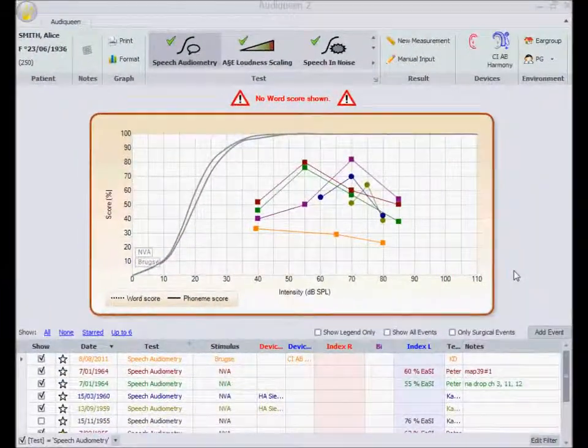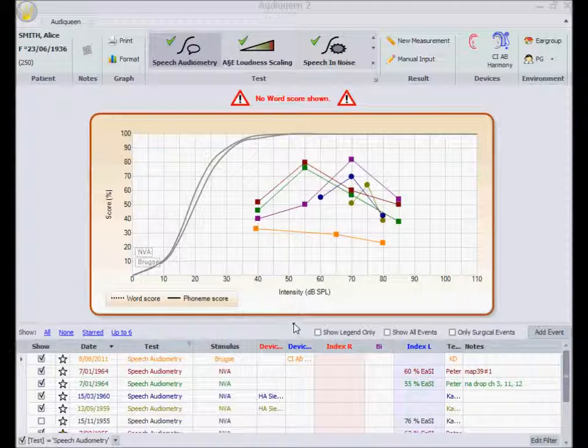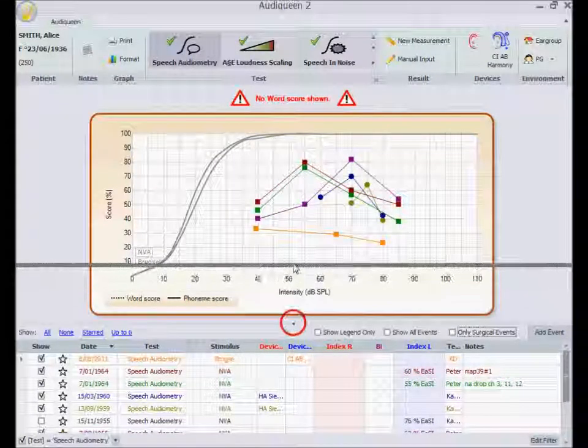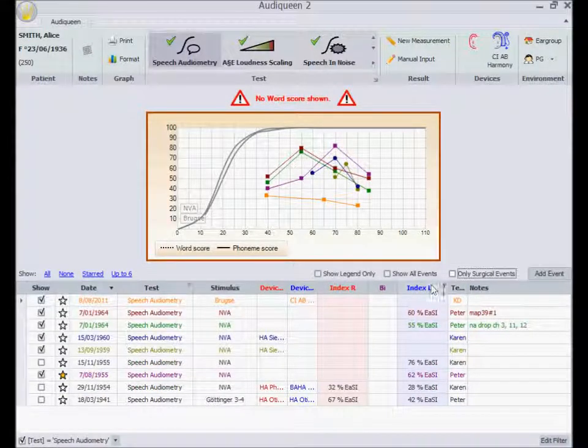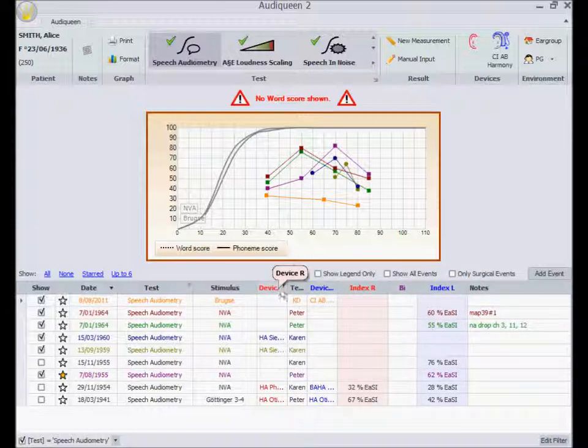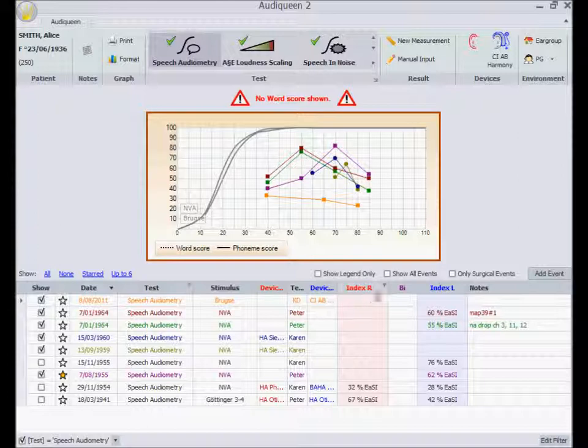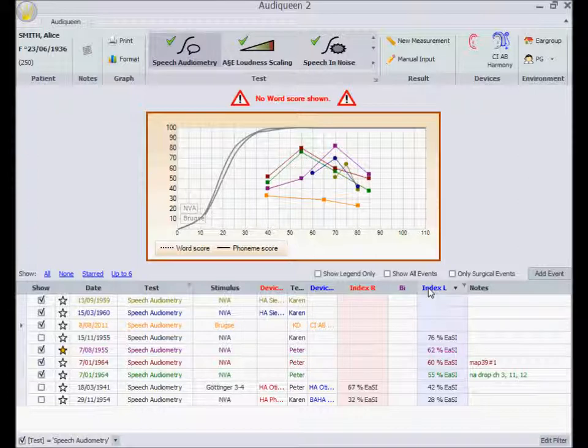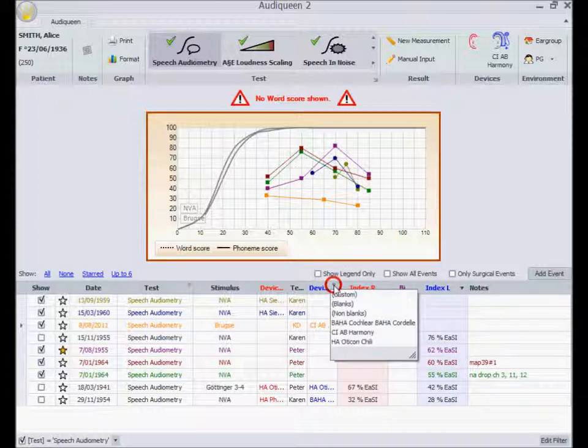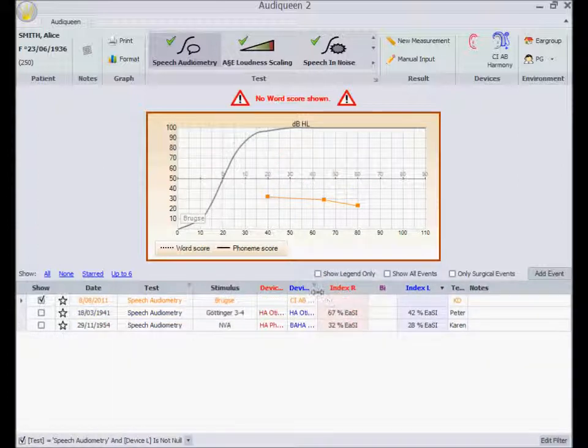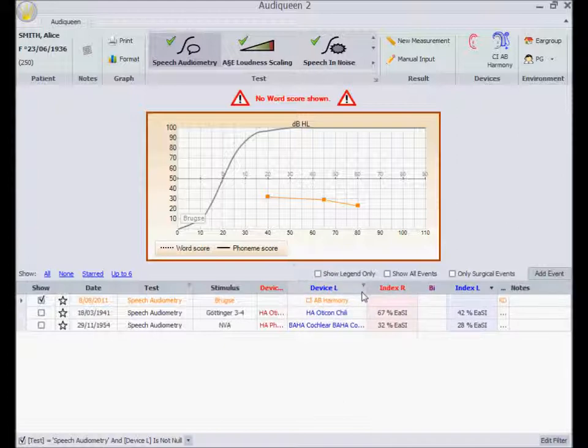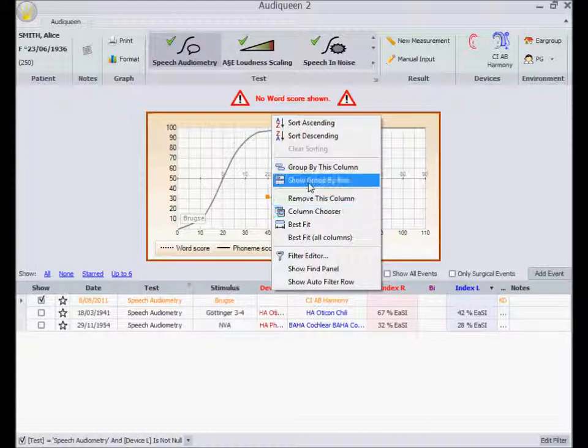I can change the window sizes, rearrange the columns, order the results, select for instance only test results with the left ear aided, or even group the results by, for instance, the type of aid.